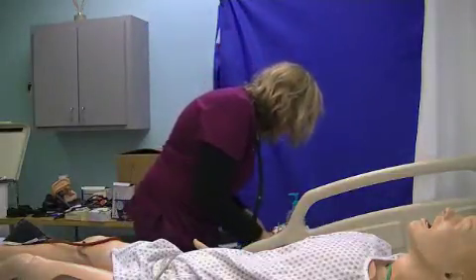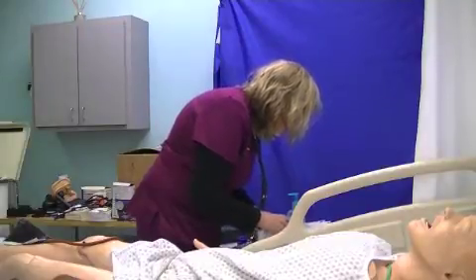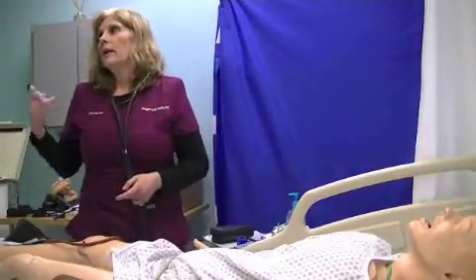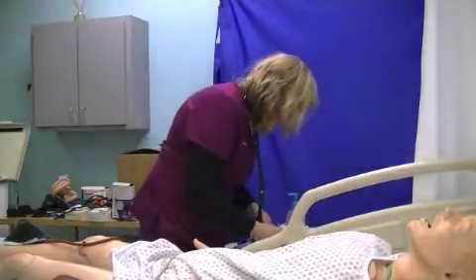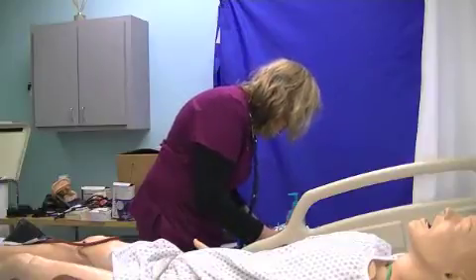Okay, so I looked for the trends already, and I'm also going to look for a corresponding change in pulse rate, because sometimes the blood pressure goes down and the pulse will go up. They could be going into shock, something like that. So you want to be careful if the blood pressure is slowly decreasing, or if it's slowly increasing, they can be filling up with fluid and have hypervolemia.